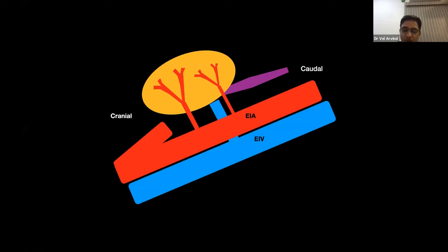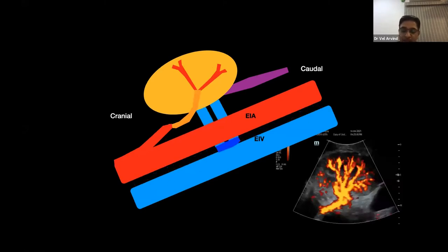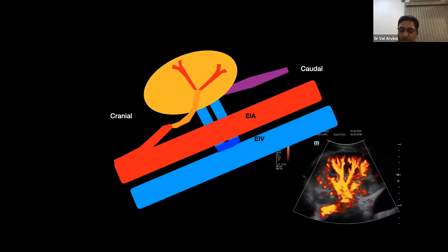So one copy, I place it in the patient file. As the patient comes, that copy will come in front of the page, rather than being somewhere in the middle of the page. This is very important information. Whether two anastomoses or three anastomoses, where it is anastomosed, a very simple diagram gives a lot of information. This is external iliac, and this is a double. We had one patient whose vein was a double, a kind of common stem anastomosed to the external iliac vein. You can see the double, two limbs anastomosed to the external iliac vein.